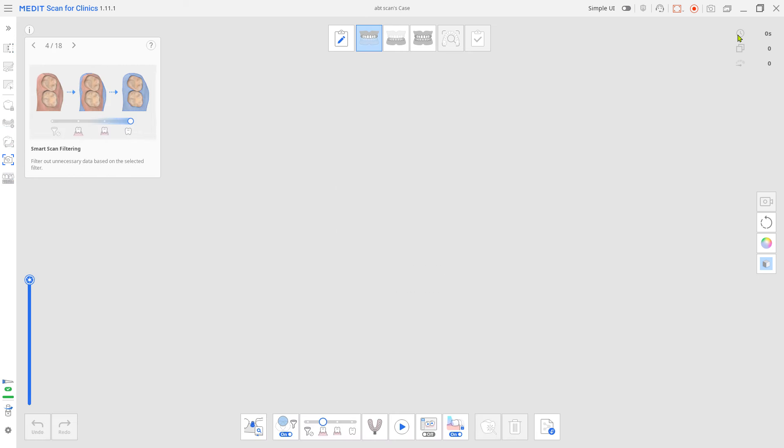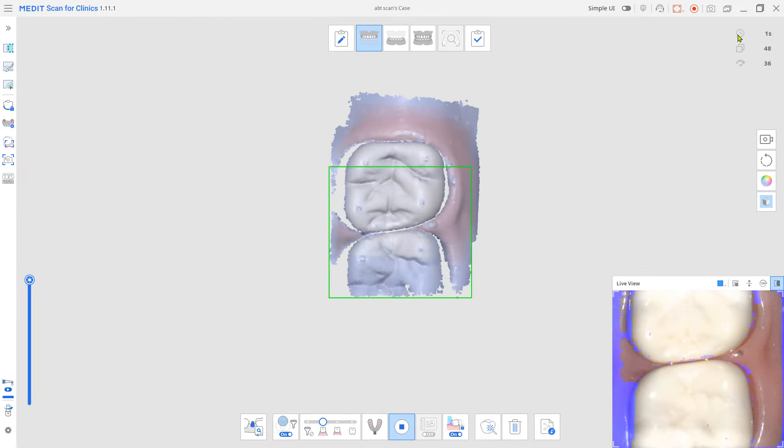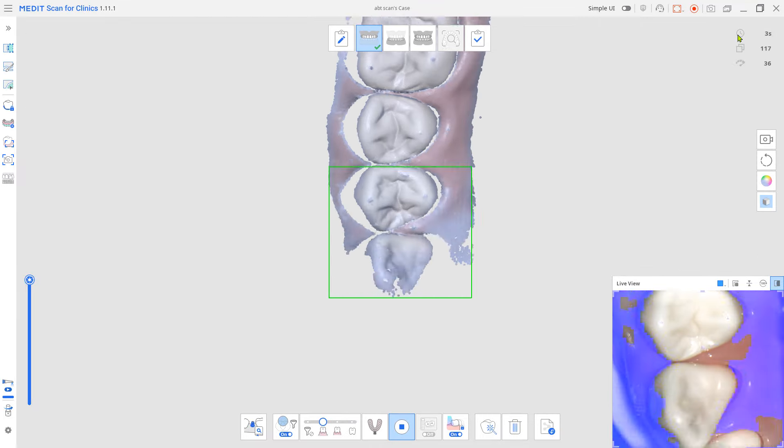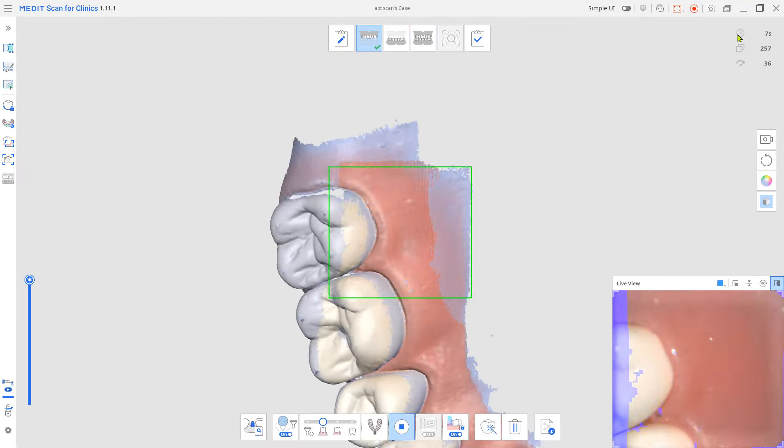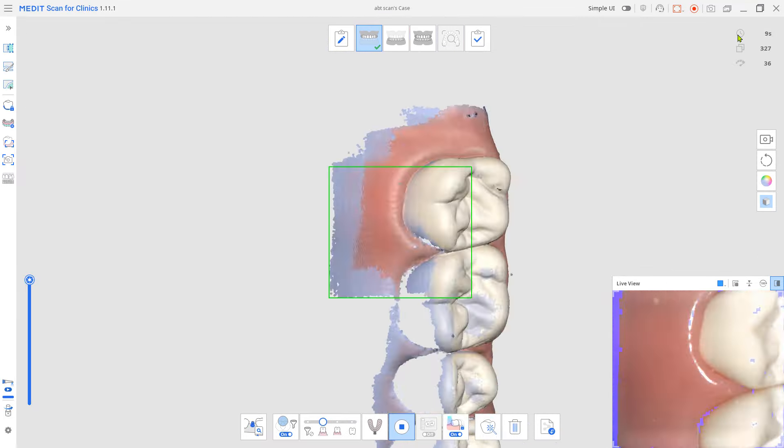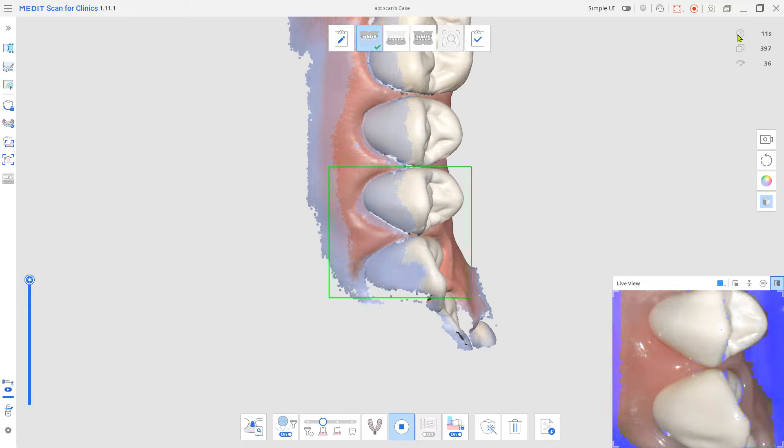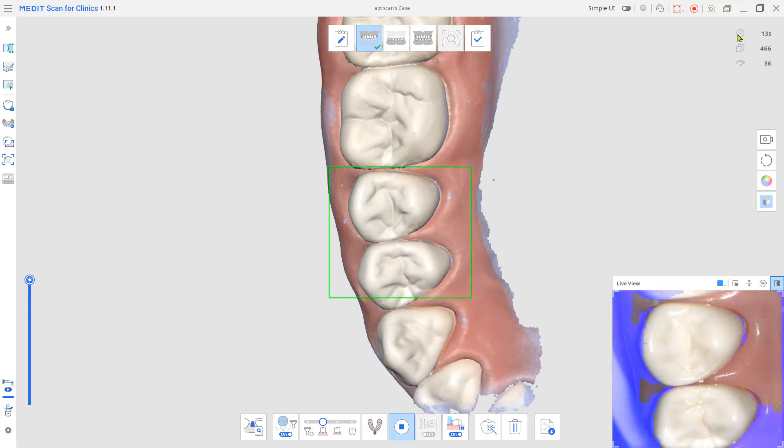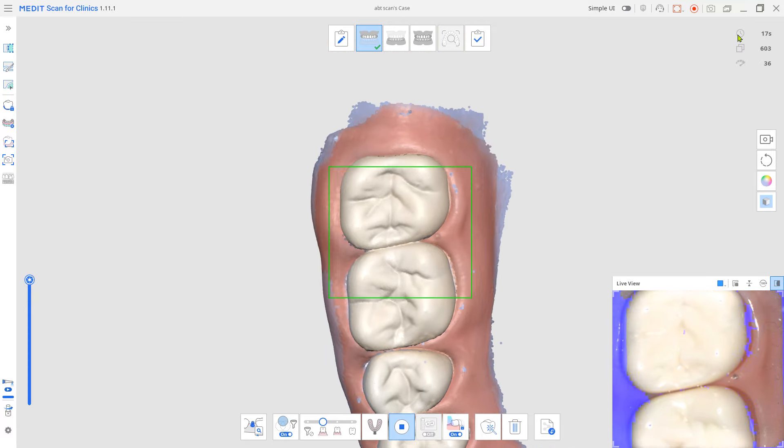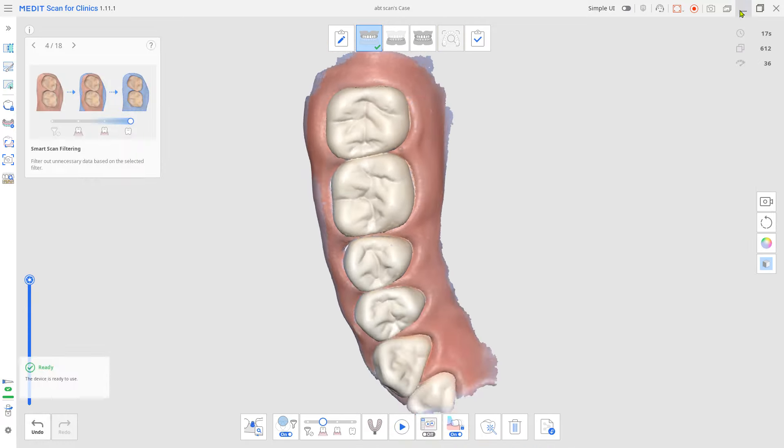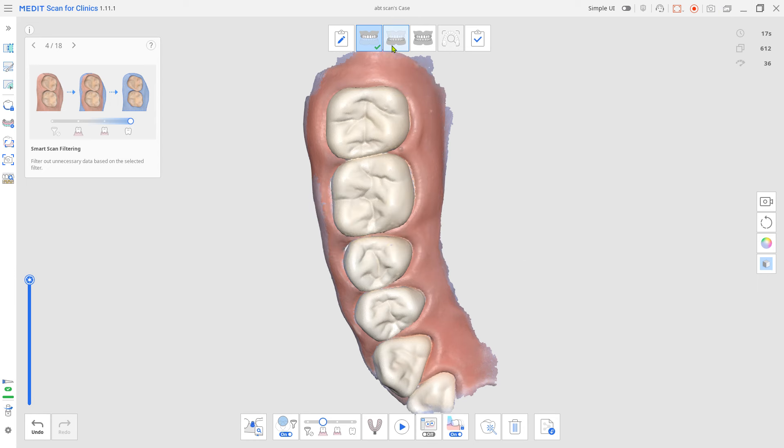Scan the antagonist. Place the abutment in and scan the implanted arch.